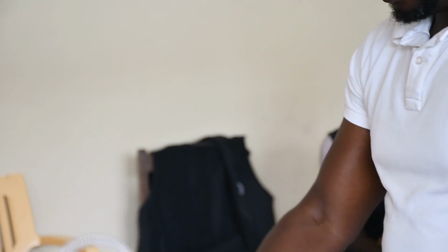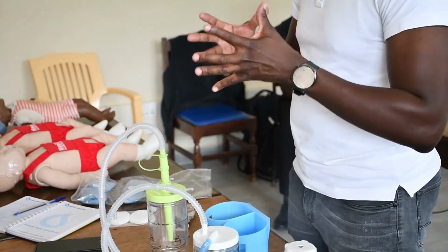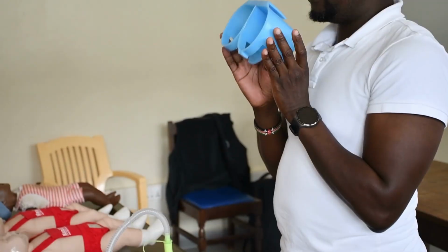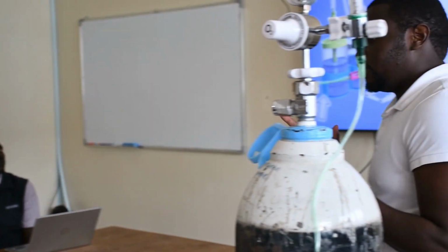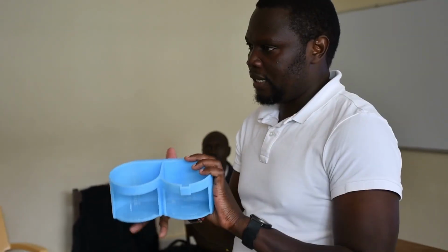Okay? So to hold this thing together, you see how these things now look like bottles held in water. You need these things to be held together. So that's why you have the warmer bracket. The warmer bracket is called a warmer bracket not because it warms, but because initially, when this was being brought to the market, we wanted it to be used with the warmer.